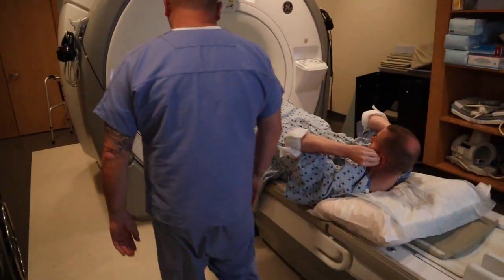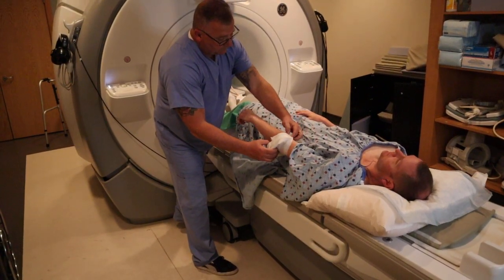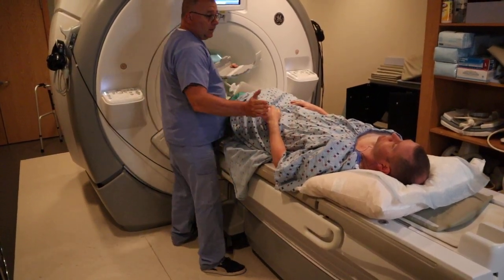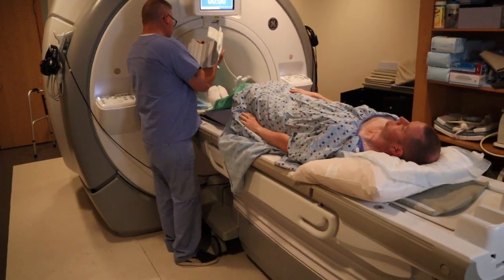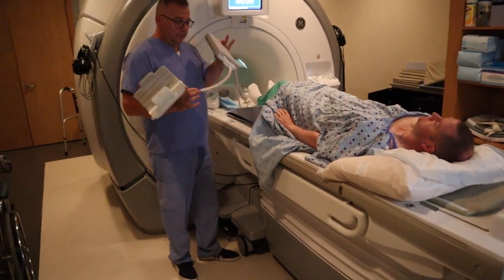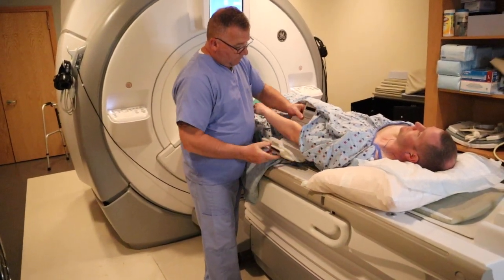We're going to take that elbow pad off. We're going to move the patient to the right, as close as possible to the edge without falling off. You want to ensure that you're positioning that elbow dead center in the coil.